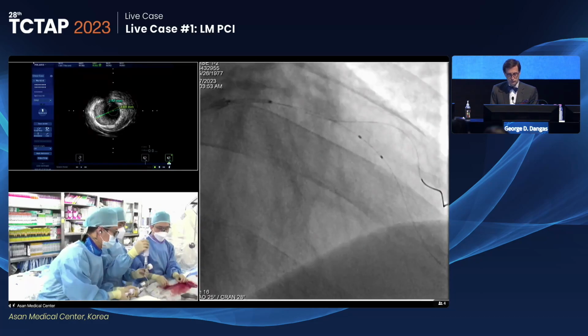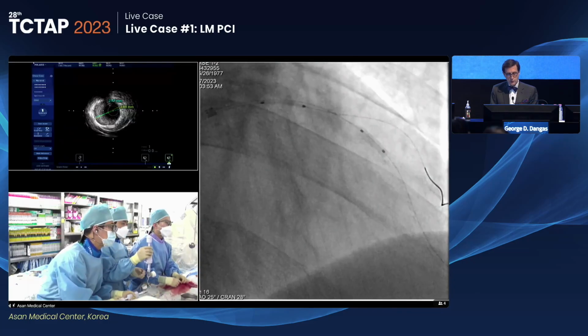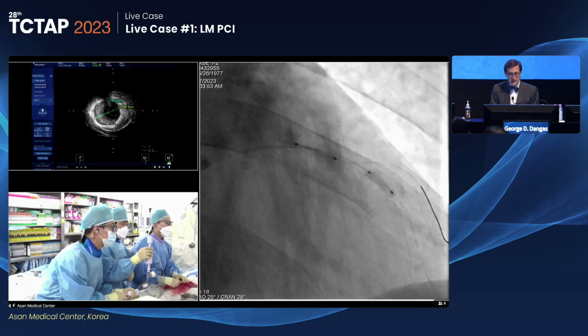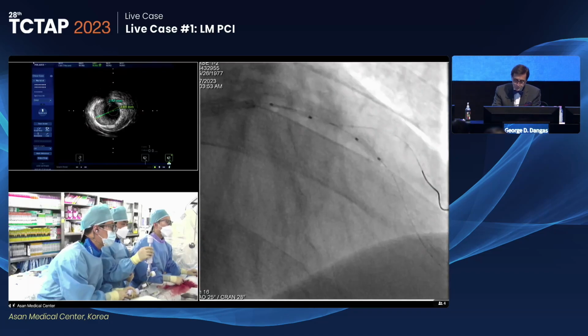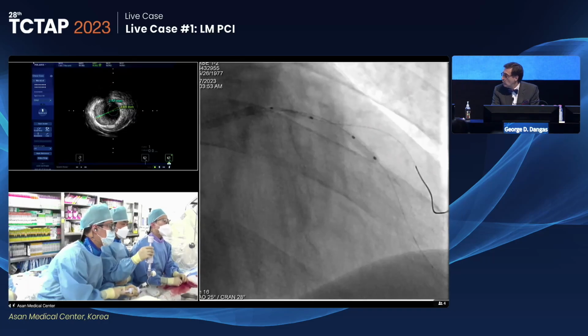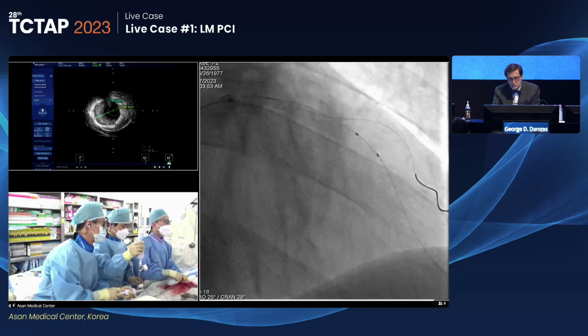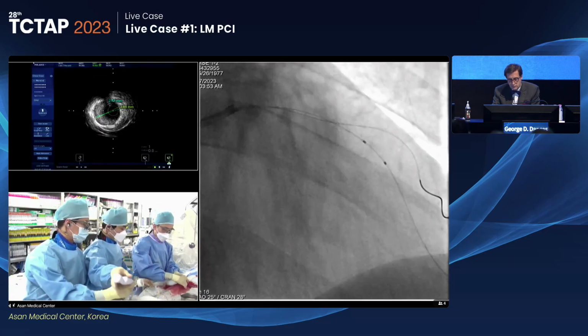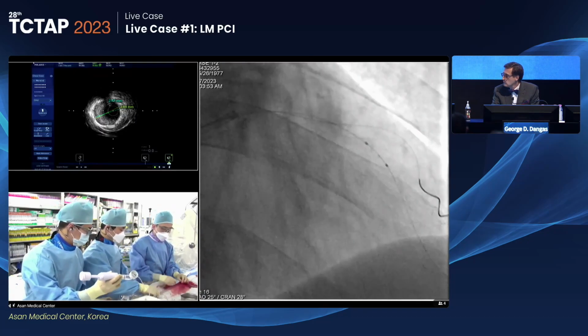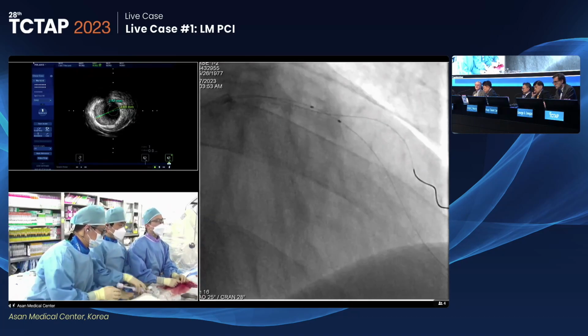You see how much work you do for nominal 3.0. You may want to, if it doesn't go again, select a shorter stent. Yeah, I agree. But maybe you don't need a stent. Or you do a cutting balloon or an angiosculpt. Why do you have to stent the diagonal? There is an occlusive dissection. What's wrong? Not to stent the 3.0 diagonal.